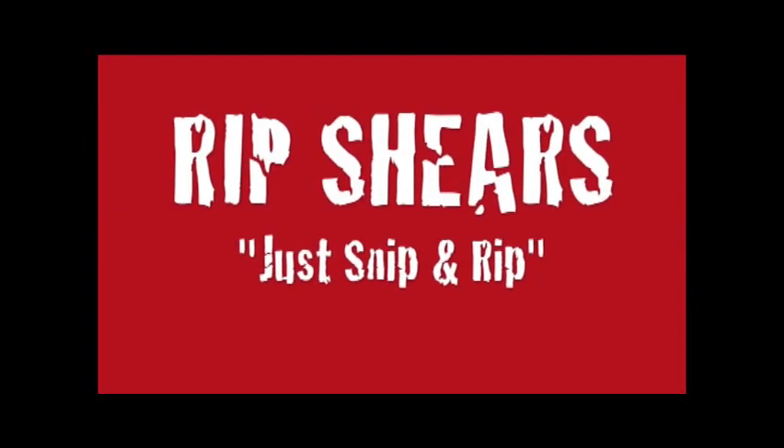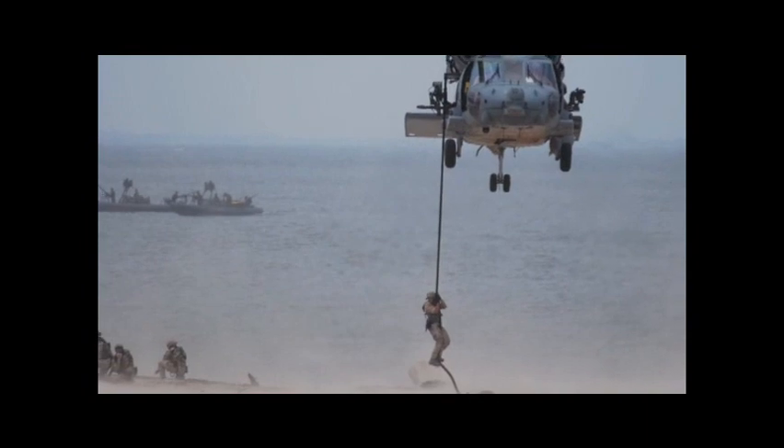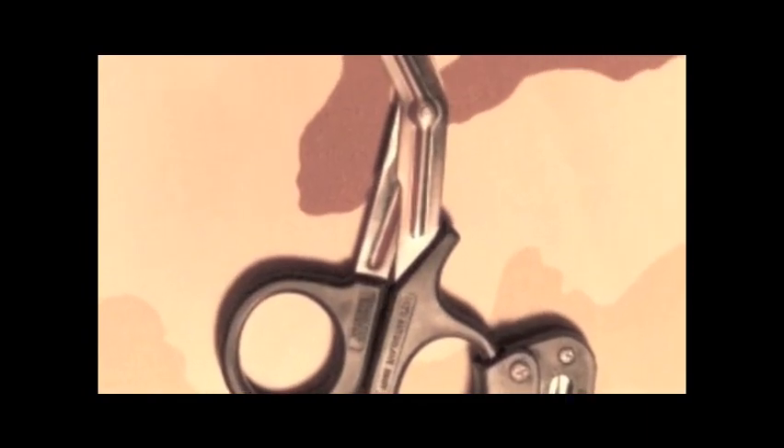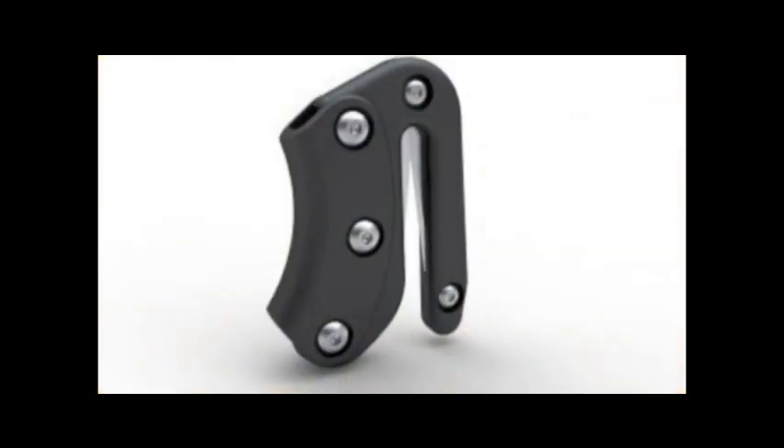Designed and tested by US Navy SEALs to perform in the harshest of environments, RIP shears will drastically reduce the critical time required to access and treat wound sites under multiple layers of clothing, equipment, and body armor. Just snip and rip.